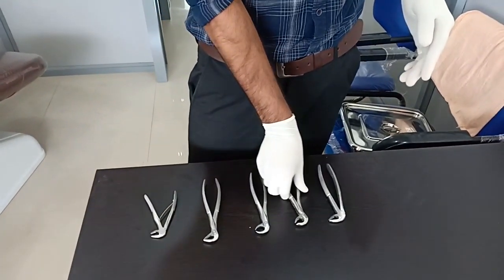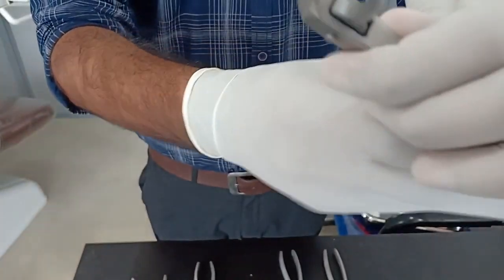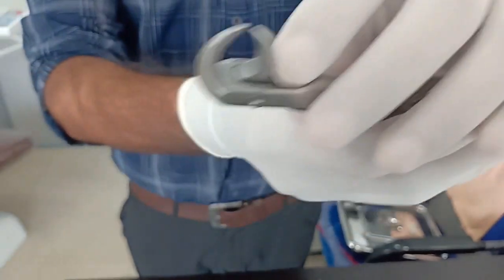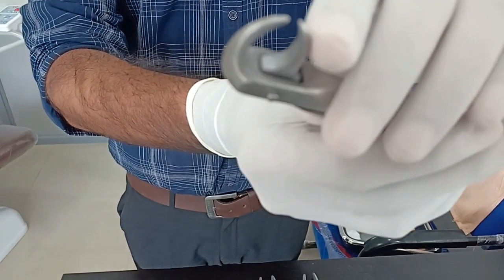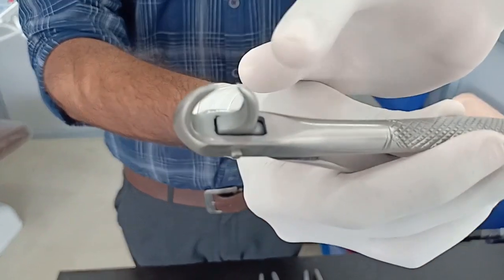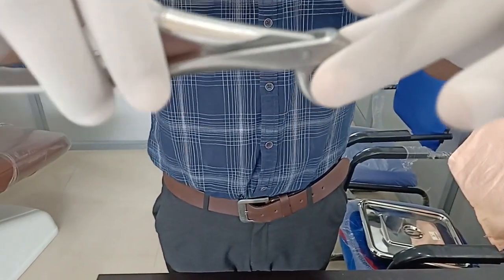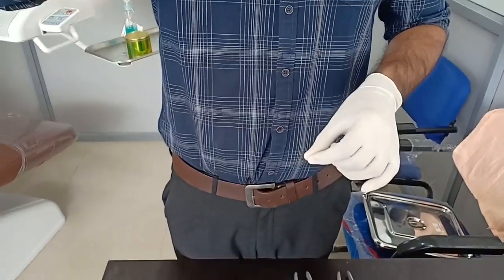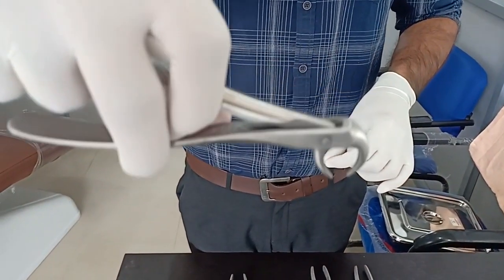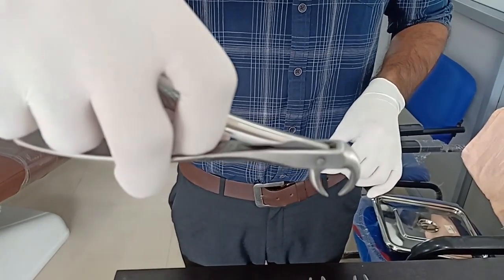This is a cow horn forceps, just like the maxillary cow horn. Here also you have the same beaks on both sides. It can be used for both right and left mandibular molars where the tooth is grossly decayed and very minimal tooth structure is remaining, so this can be engaged very apically to perform the extraction.